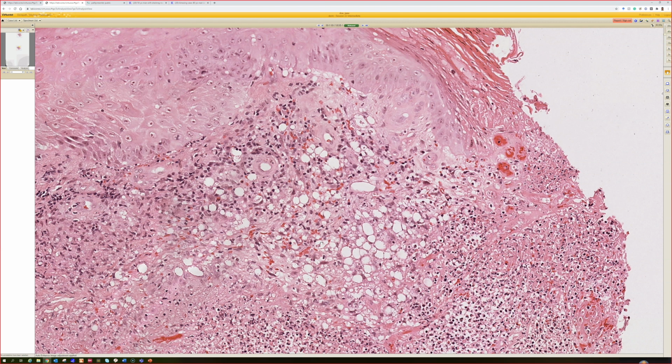I'll also tell you one of the best things that I found is to do a GMS stain, which to my knowledge should not stain Leishmaniasis, but also histo, which looks very much like leish. Suddenly, when you do GMS, it changes. You can see that they're little tiny organisms about the same size, but they have budding.